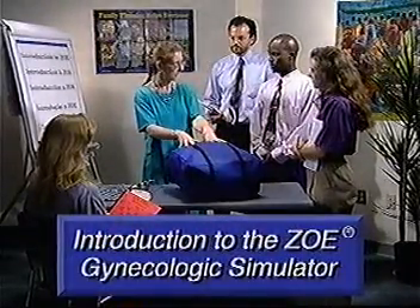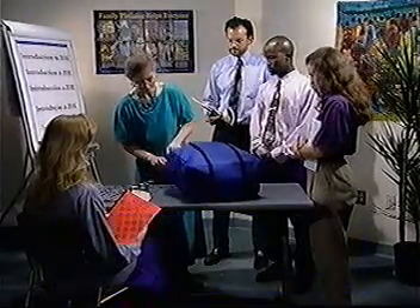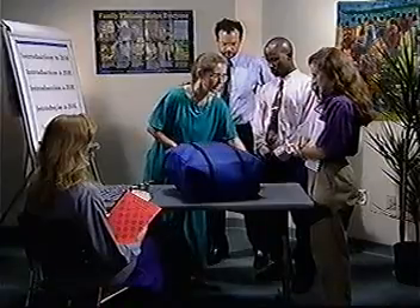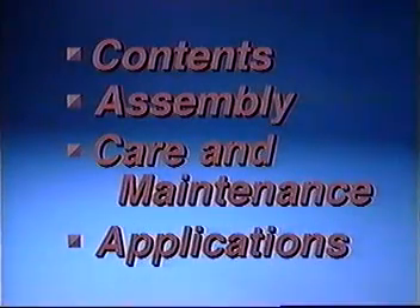Your ZOE Gynecologic Simulator is an ideal tool for both demonstration and practice. This video will introduce you to the contents of your ZOE kit, show you how to assemble the model, how to care for and maintain it, and what some of its applications are. The information presented here also can be found in the instructional manual included with your kit.